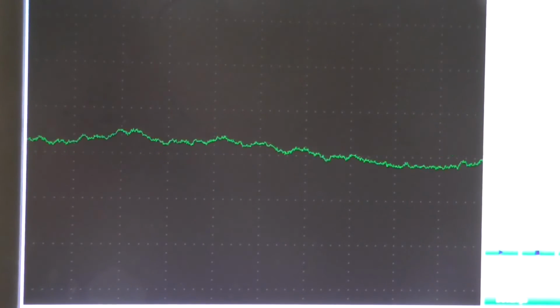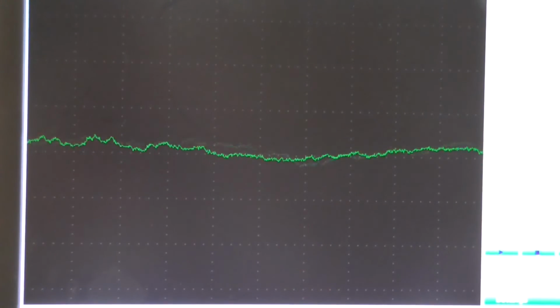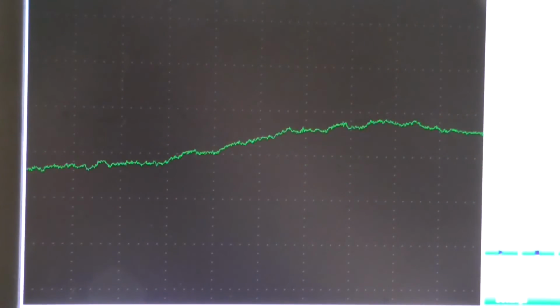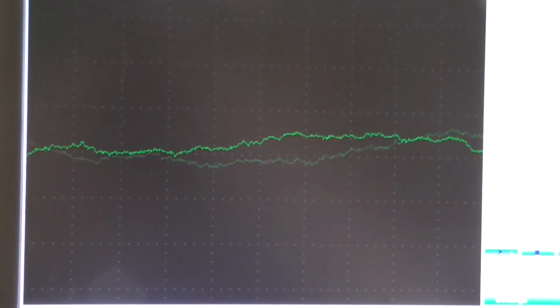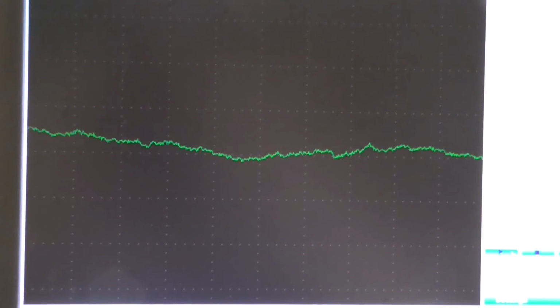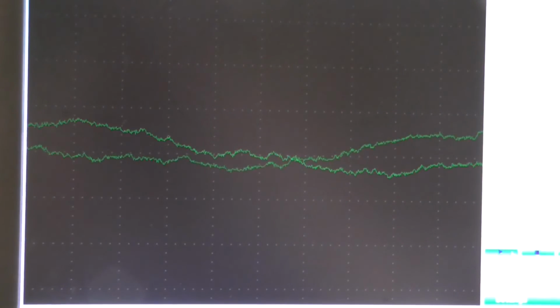I'm going to show you a great example of a myopathic muscle, and the first thing you're going to hear is actually a burst of complex repetitive discharges here. So the needle's just gone into the muscle, and you're now going to see what's happening.